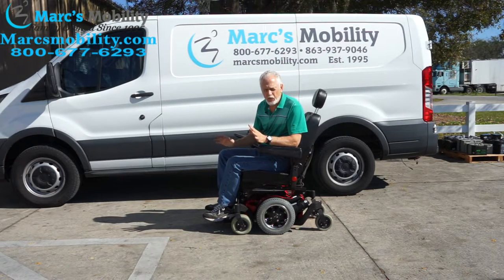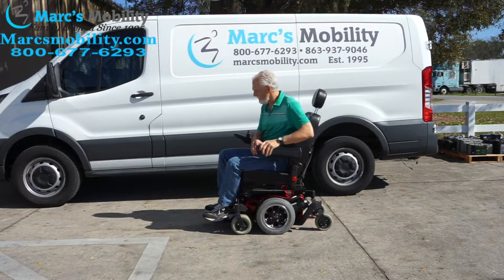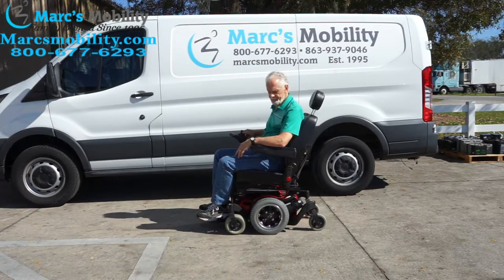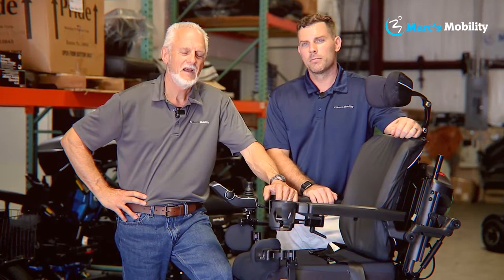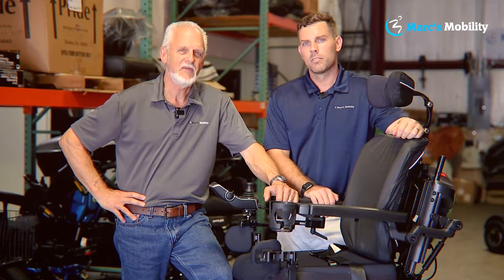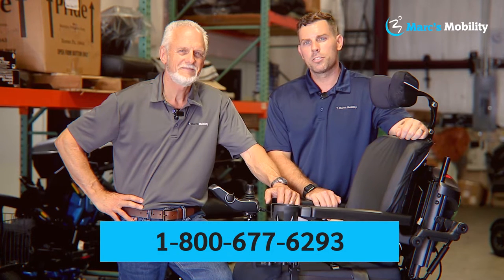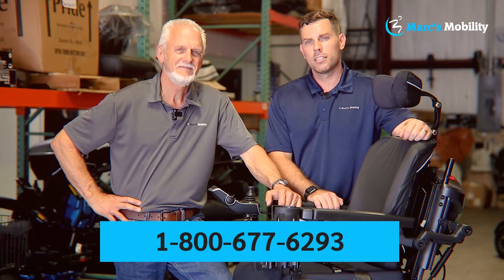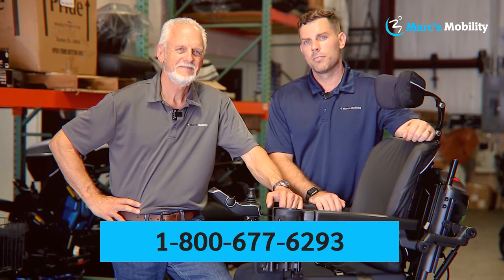Again, this is the Quickie Pulse 6 made by Sunrise Medical — a high-quality chair. The seat is 19 by 19 captain seat. This is a really sharp, quick power chair. I'm Mark and my name is Alex; we're co-owners of Marc's Mobility. I started this company in 1995. We sell many products — if you have any questions, please call us at 800-677-6293. Thank you and have a wonderful day.